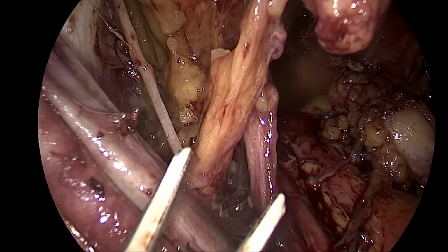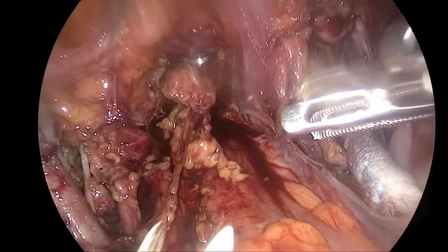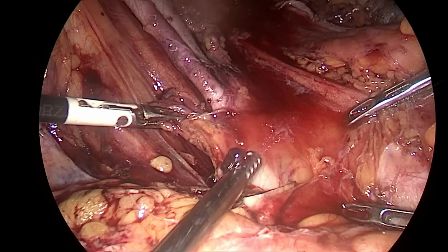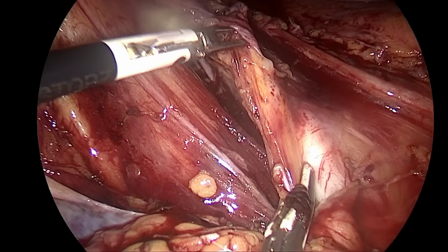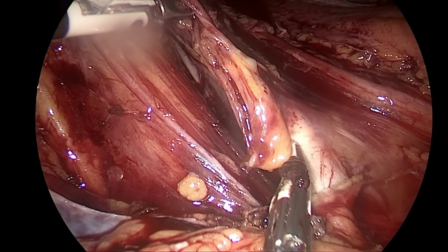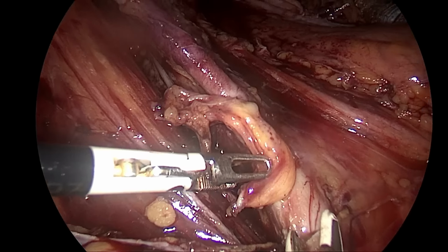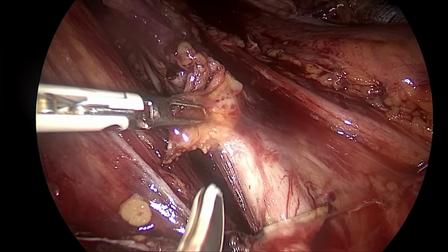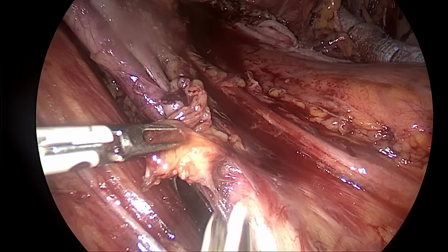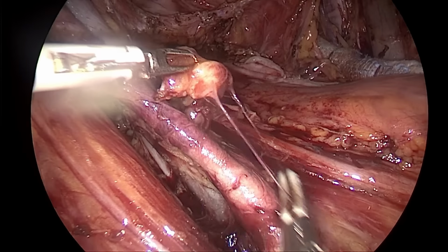The last part remains, the internal iliac chain, and the left-sided pelvic lymphadenectomy is complete. So now moving upward in the left common iliac. Some enlarged left common iliac nodes are also there. So this left common iliac lymph node is being removed. So once that is done, we will be moving forward with our para-aortic dissection.